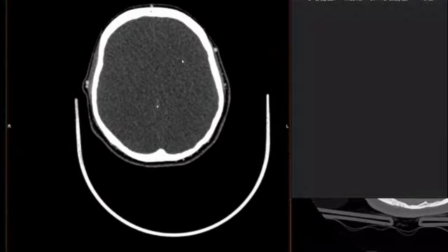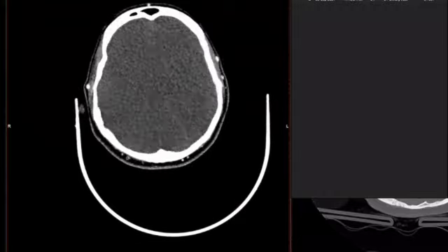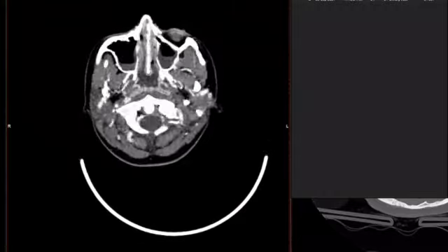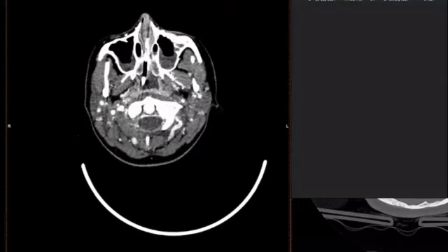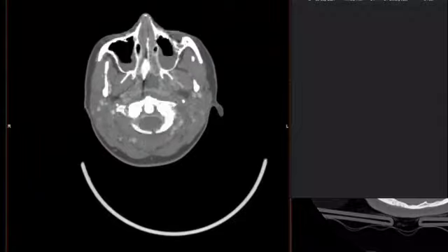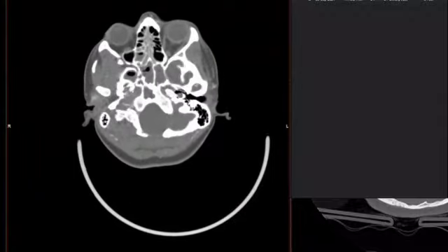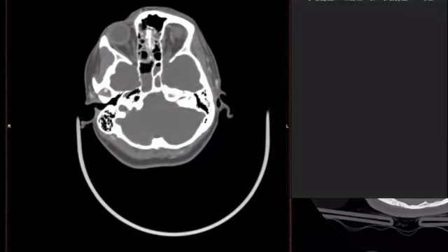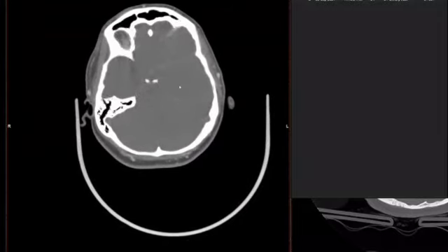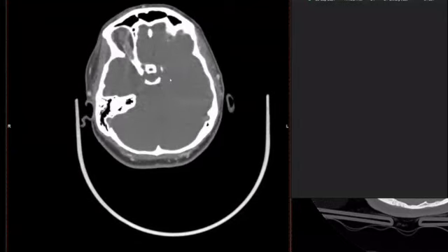But this is the study where you're looking to see if there's any opacification of the middle cerebral artery cortical branches, and you can just see, I think, the carotid bifurcation here. But there's absolutely no contrast. It hasn't even got to the petrous portions of the internal carotid arteries. There is absolutely nothing. There's cerebral silence here. There is no flow.